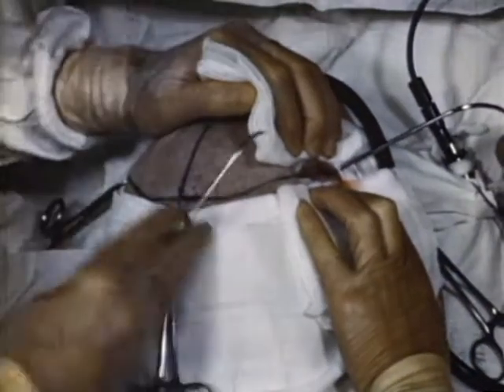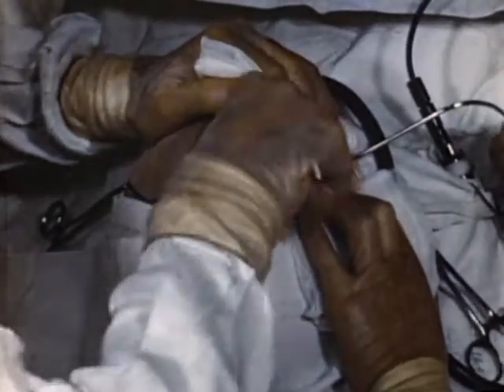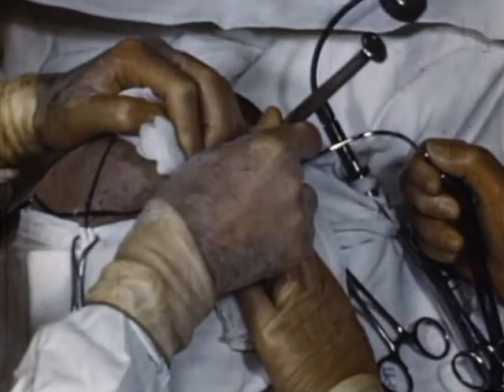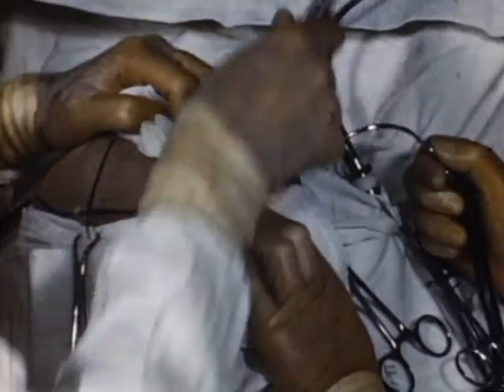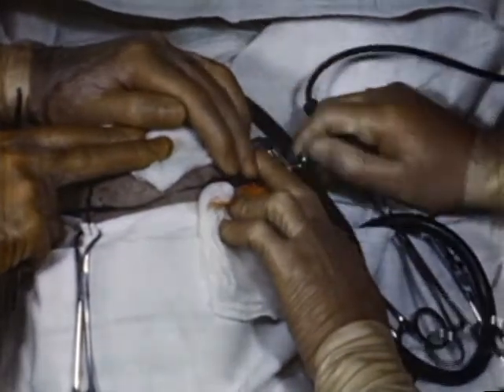The periosteum is scraped off and markings are made with a chisel. The wound edges are then retracted with a self-retaining mastoid retractor.